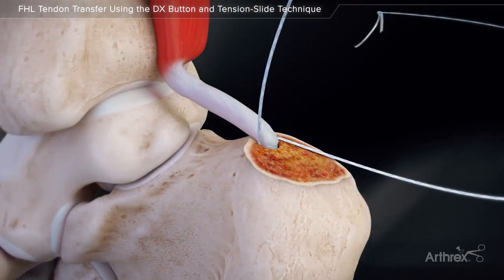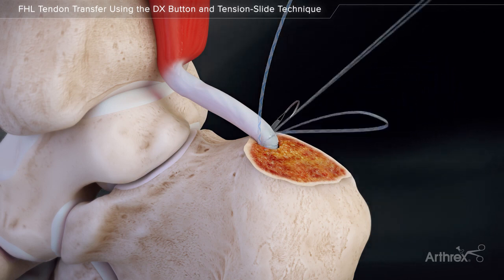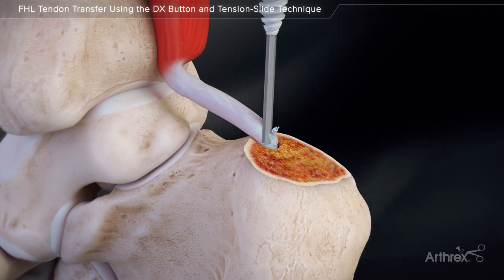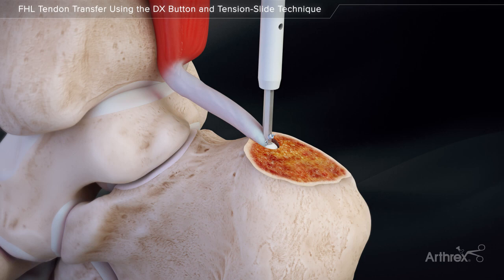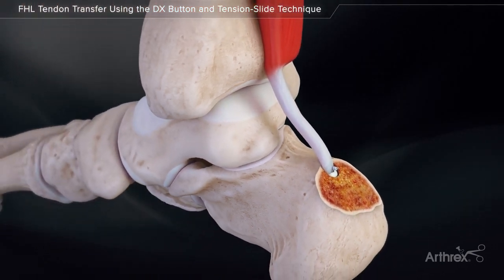Once the tendon is fully seated, use the free needle and pass one suture limb through the tendon and tie 3 to 4 knots. Insert a 6.25 mm or 7 mm tenodesis screw for aperture fixation. The screw should sit flush with the cortex. Cut the excess suture and fixation is complete.